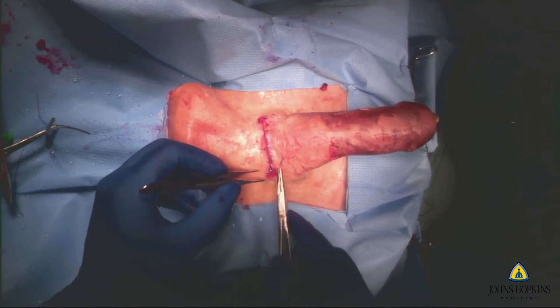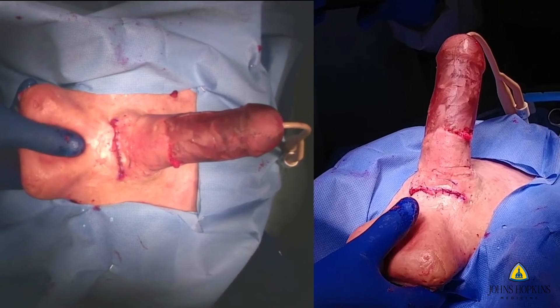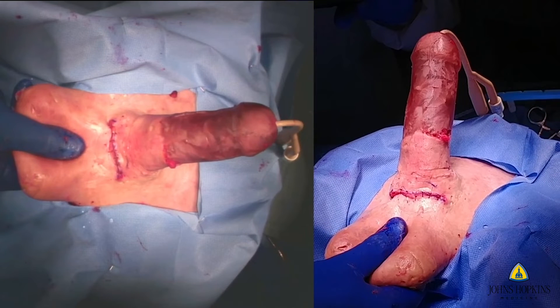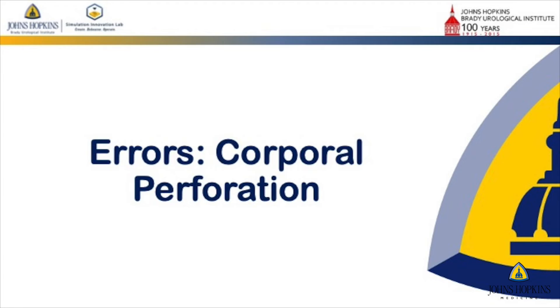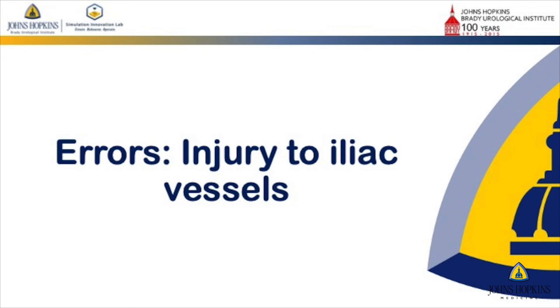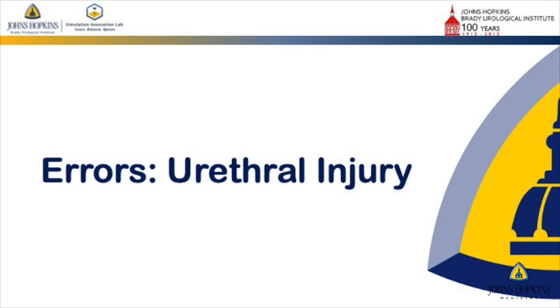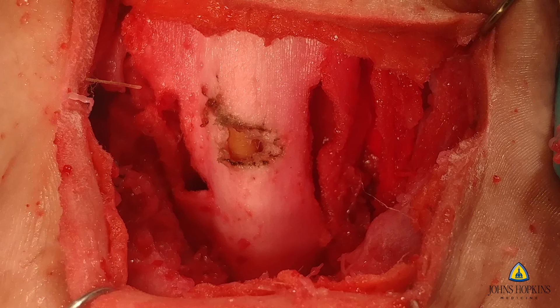You can see here in the demonstration that after pumping the pump, the reservoir fills the cylinders and it's a clear, successful implant. But more important than creating a realistic simulation is recreating the errors, like perforation of the corpora if excessive tension was placed during the dilatation process, as you can see here. This took a lot of R&D. We also placed iliac vessels inside the model to really recreate injury of the iliac vessels during ectopic placement after a radical prostatectomy, and of course a urethral injury as was shown in the model and also in the video.